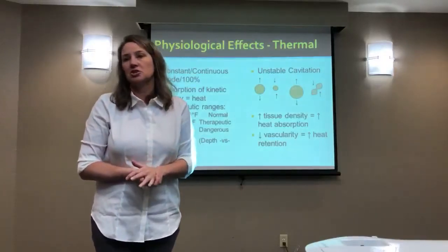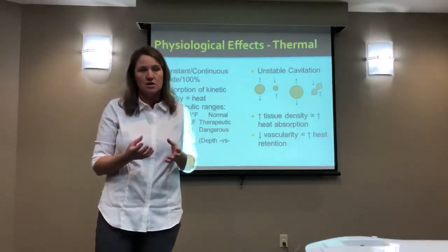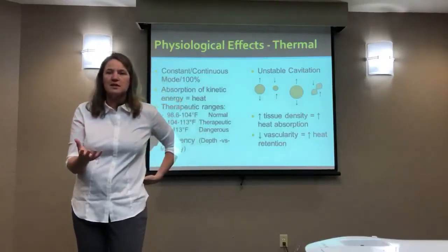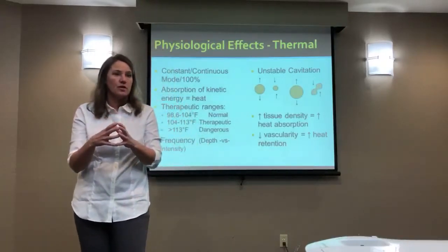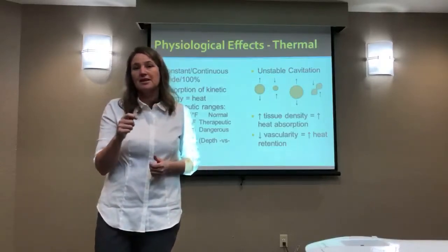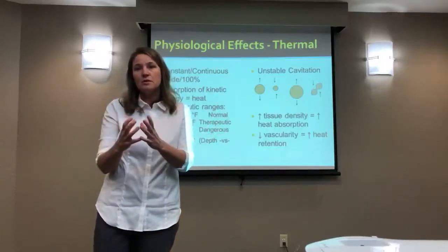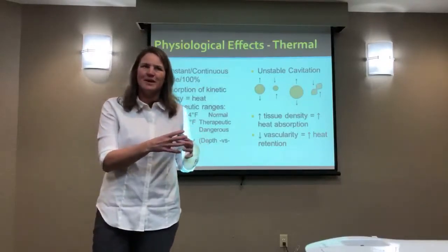Now when you think about muscle tissue, yes, it is dense, but it's very vascular. It's a different type of collagen. So when you attempt to heat a muscle, it's going to be more difficult for it to retain the heat. And so when I do a treatment, let's say for a muscle spasm over an area of maybe a muscle trigger point, or an area where you feel an isolated area of denseness in that muscle, I'm going to do typically longer treatments than I would do on the tendon attached to that muscle, simply because it's harder to heat it up. The effects won't be as long lasting, but the effect would be more blood flow, and that could be of great benefit. Versus in the tendon, my goal might be different.